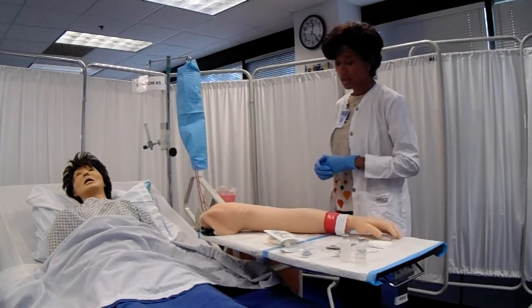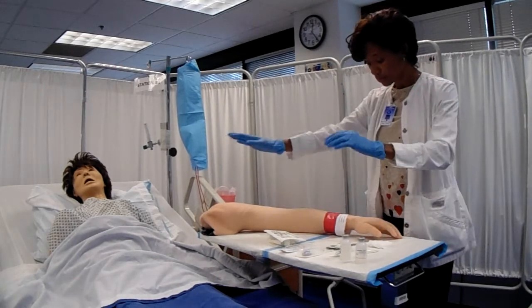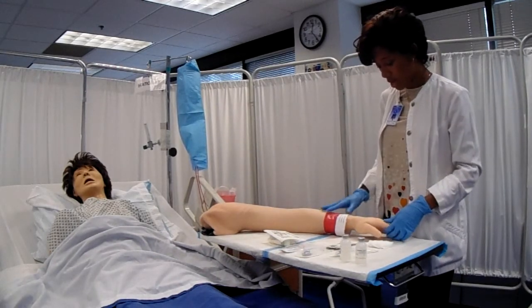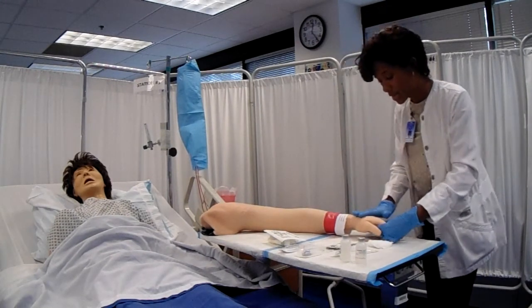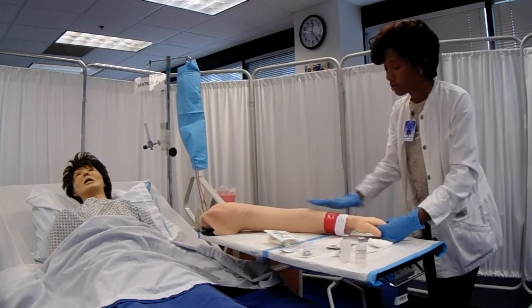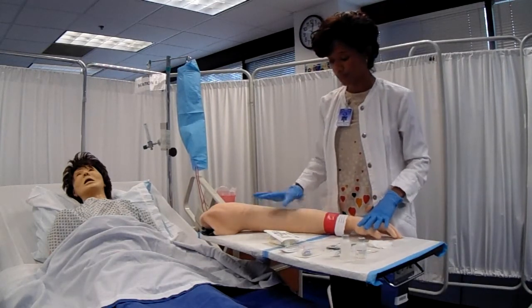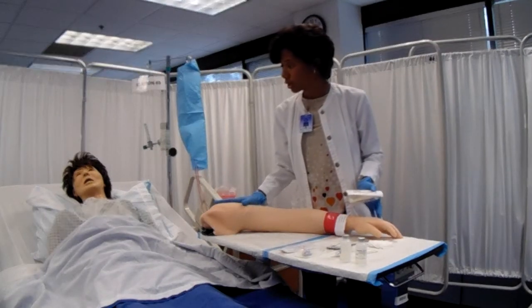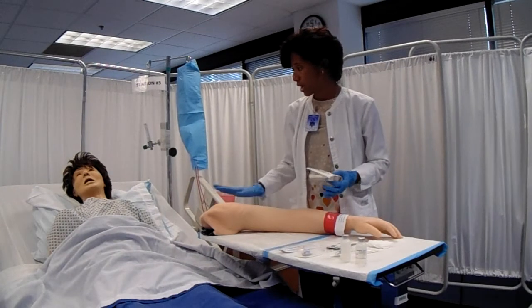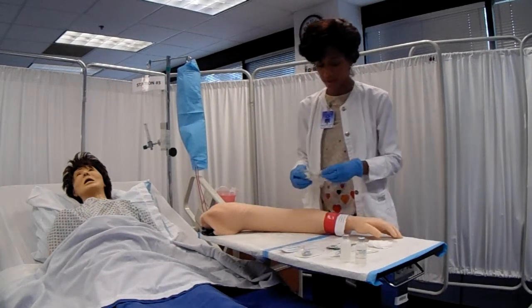Yes. Okay, great. So at this time I'm going to go ahead and expose your arm so I can take a look to see which veins would be best for me to use. We usually like to use the veins in the hand first because they're most distal, and if anything goes wrong we can move upwards along your arm. Are there any contraindications to me using your left arm? No, it's okay. That you didn't have any special surgeries or implants? No. Okay, great. Thank you.